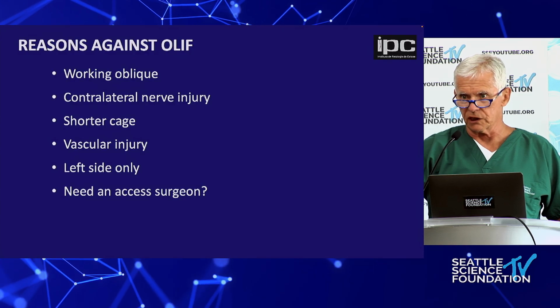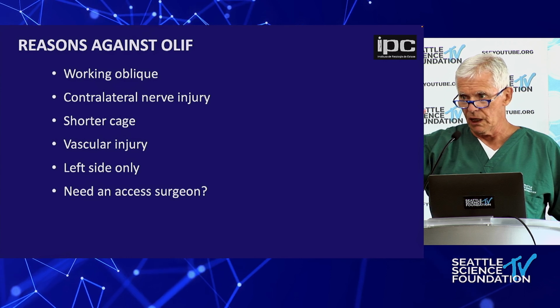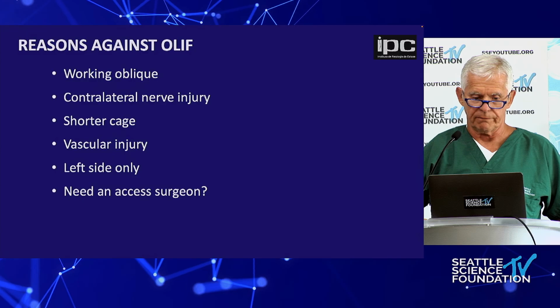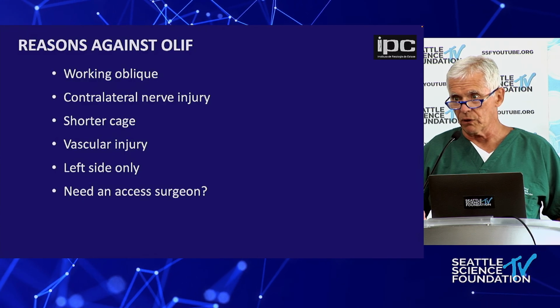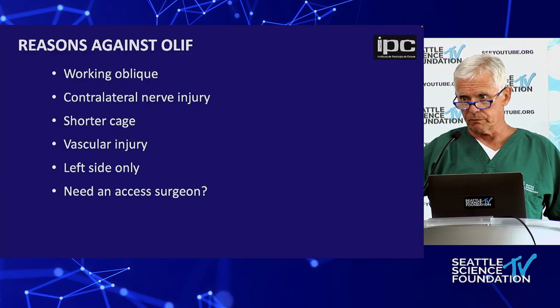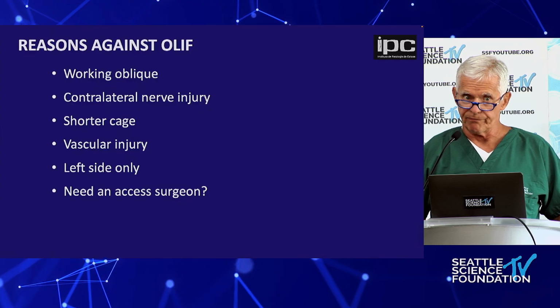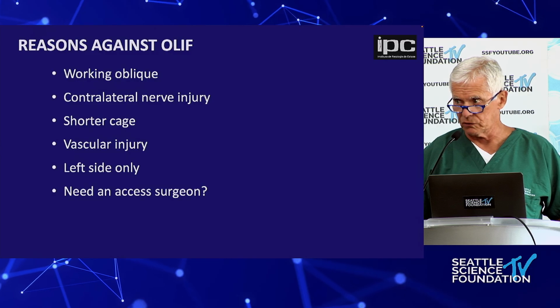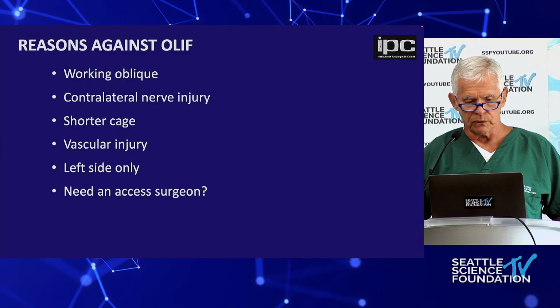Deformity surgeons would do this in an open fashion, like a shark bite procedure, dissecting the psoas backwards. Although they don't use neuromonitoring, they report neurological complications because the plexus is pushed back. Once the plexus moves, the nerve may suffer depending on how close you are and how much you distract the plexus. We learned this and we try to avoid it.